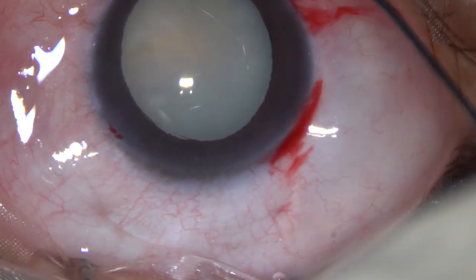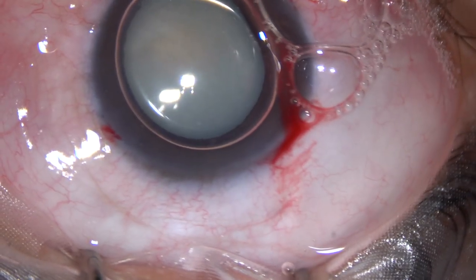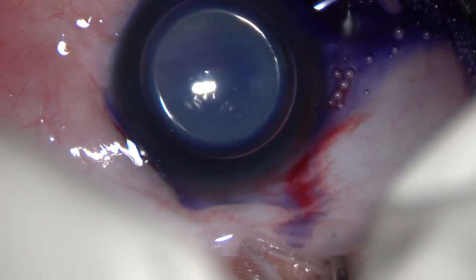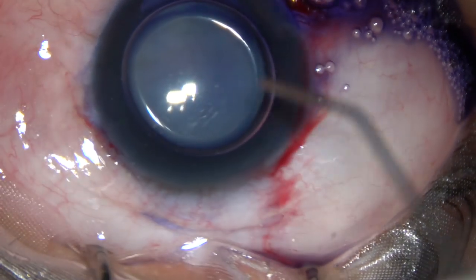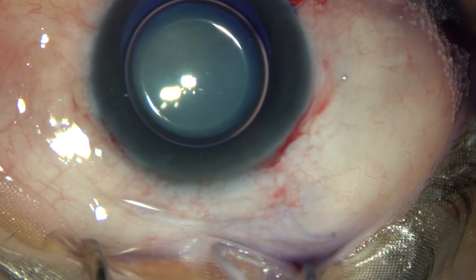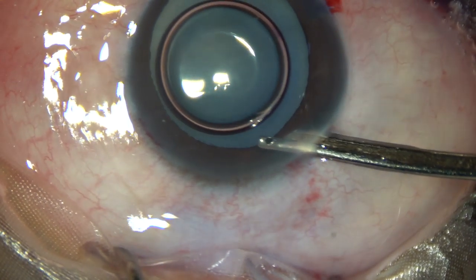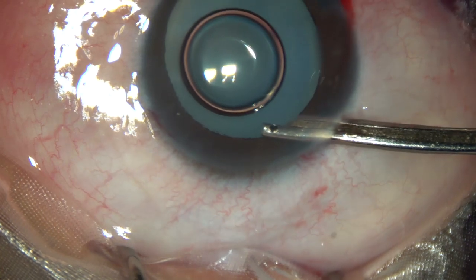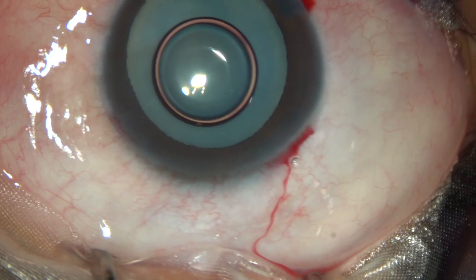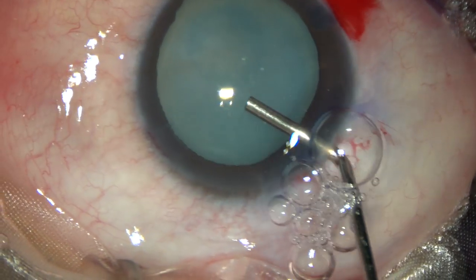An air bubble is injected into the anterior chamber. And beneath this air bubble, trypan blue 0.06% dye is applied over the anterior capsule of this white cataract. And now this is a bit of adrenaline. After this, the dye is washed out. And then 2% hydroxypropylmethylcellulose — that is HPMC — is used as the viscoelastic substance to fill the anterior chamber.